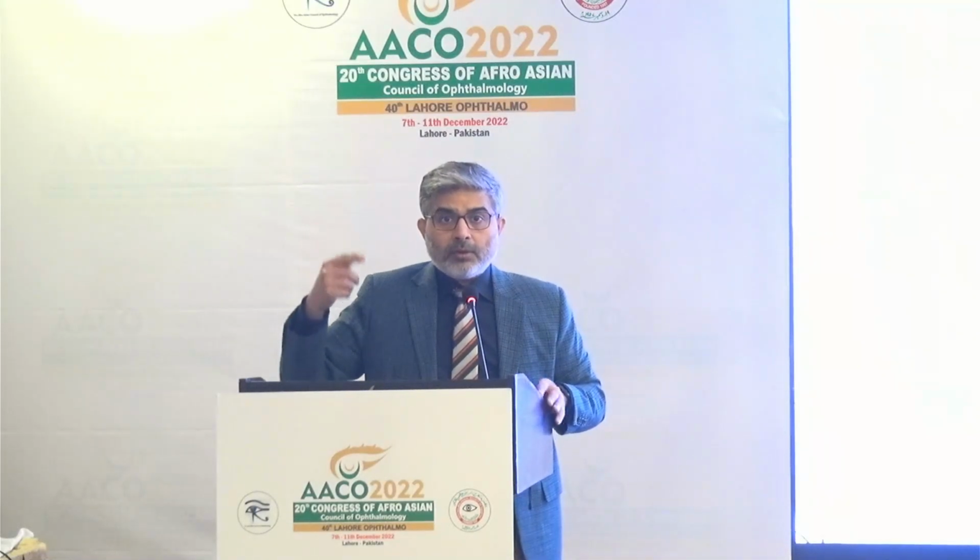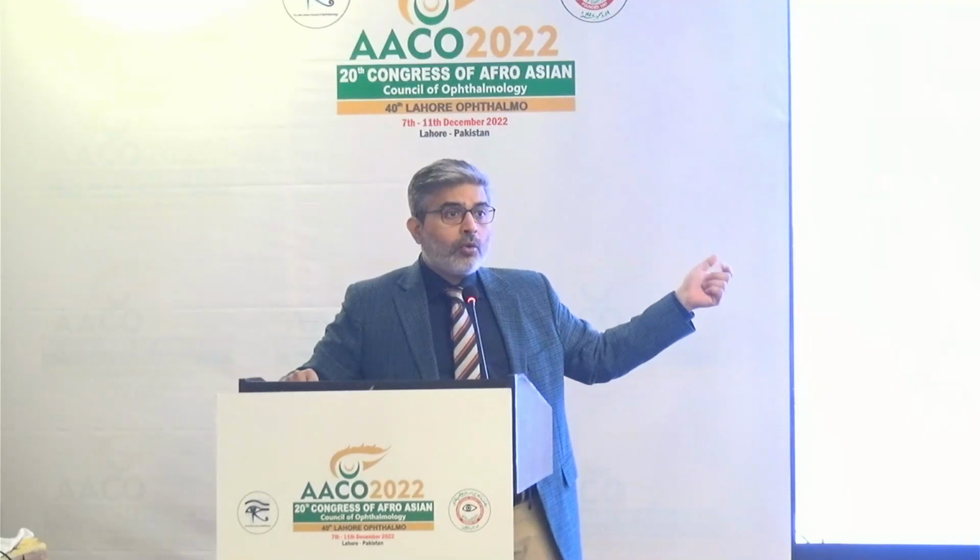It's not going to be a doctor, it's going to be a technician or technologist who's going to take this camera scan, and this will be loaded through the net. But what we are developing, the first talk was about developing a model that works on mobile without internet.